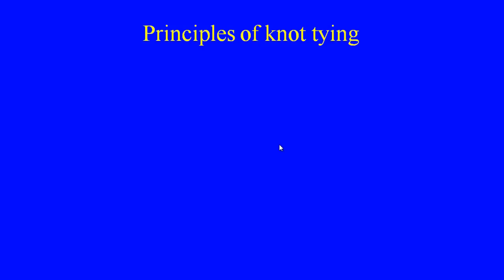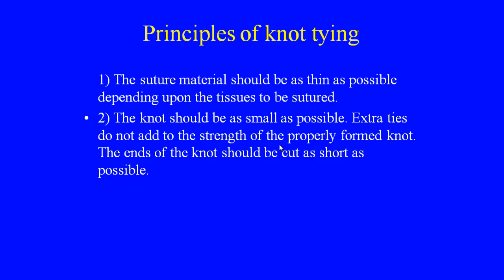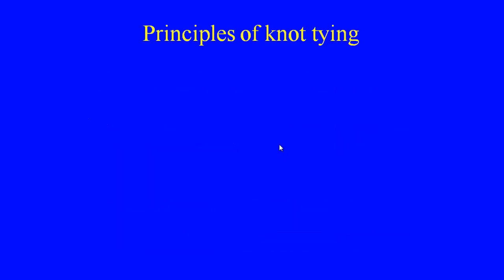The principles of knotting. The suture material should be as thin as possible depending upon the tissues to be sutured. The knot should be as small as possible. Extra ties do not add to the strength of the properly formed knot. The ends of the knot should be cut as short as possible to reduce the load of foreign body in the tissues. If you make more ties than is required, the strength of the suture material goes down. Excessive friction should be avoided between the strands of the suture while forming the knots, as it may cause fraying of the suture leading to weakening of the suture material.